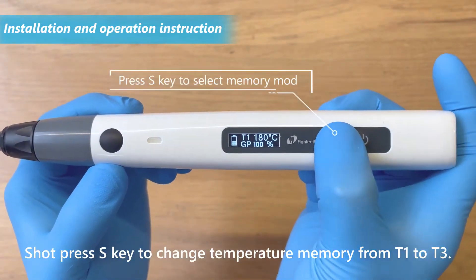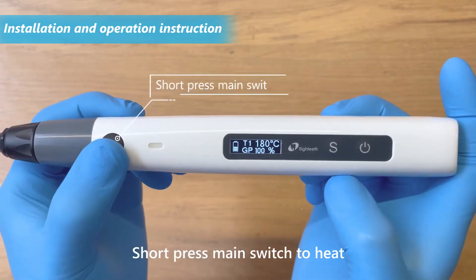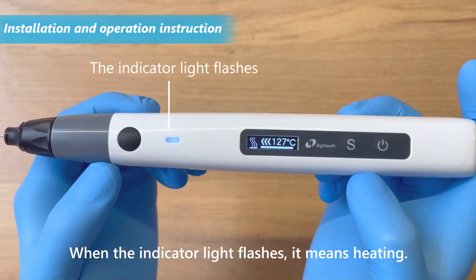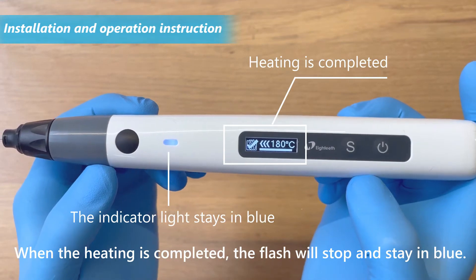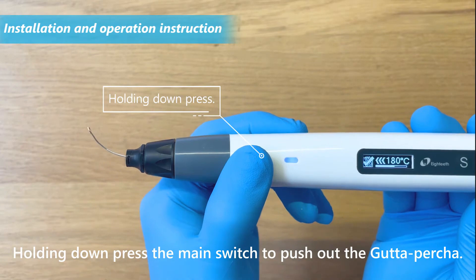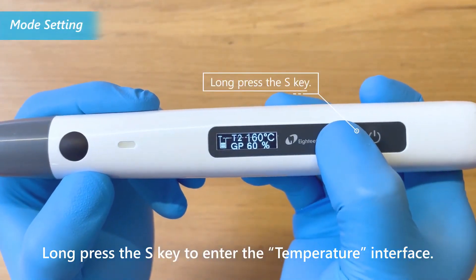Long press the power switch to turn on the device. Short press the S key to change the temperature memory from T1 to T3. Short press the main switch to heat. When the indicator light flashes, it means heating. When heating is completed, the flash will stop and stay in blue. Hold down the main switch to push out the gutta percha. Long press the S key to enter the temperature interface.